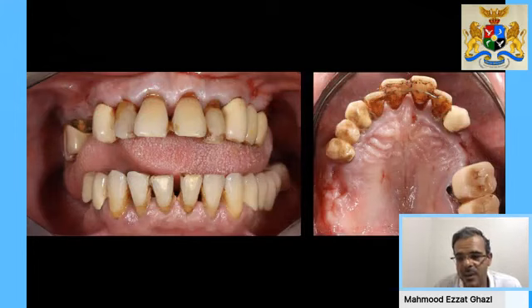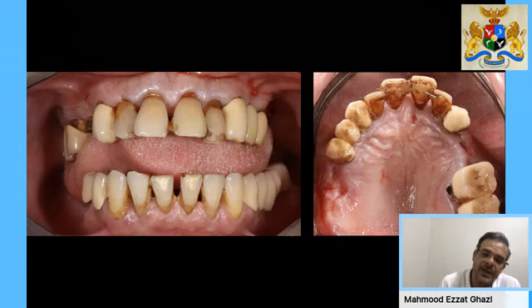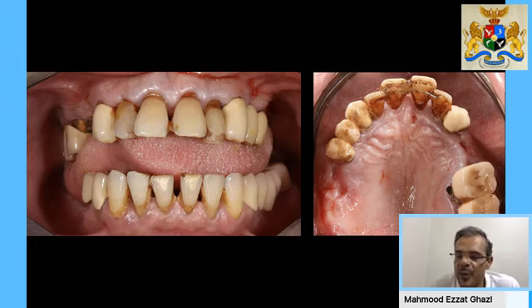Fully edentulous cases, or let's say a case with hopeless teeth where you need to place full arch implants. This was a case where I didn't do the surgery, but these are some of the difficulties that we are all going through with full arch cases. It's not that difficult, of course, to place the implants because you have a large area to place your implants. I prefer doing this guided, not only to place the implants in the correct position surgically according to the bone, but because it will differ in your prosthetic phase at the end, because the nightmare usually is in your prosthetic phase.